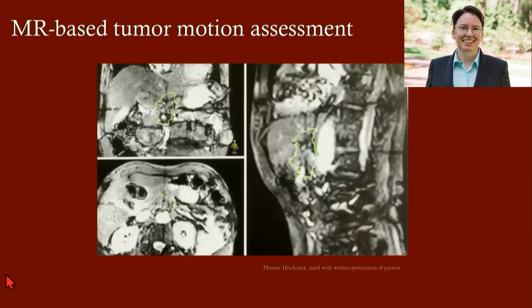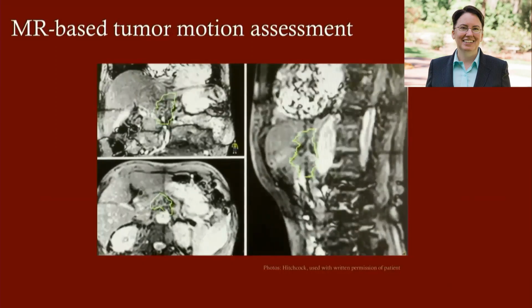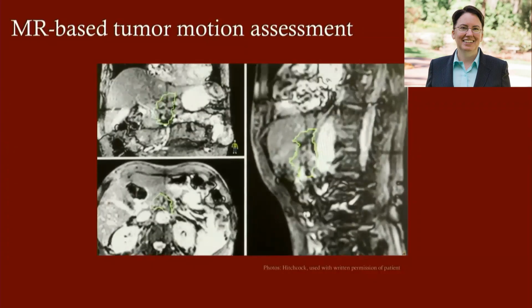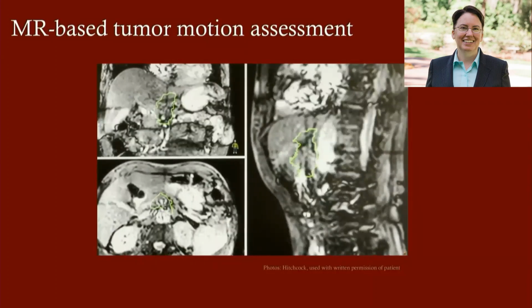There we go. Here's another thing that I didn't expect. Now, during my PhD in medical imaging, we were focusing a lot on stroke. And at that time, which wasn't that long ago, you couldn't get an MRI of a stroke patient's brain because they would be in the machine too long and it would delay their ability to get to clot busting drugs and save their lives. Now I'm standing there watching my patient breathing on an MRI, and you can see, even despite the motion, how clear that is.